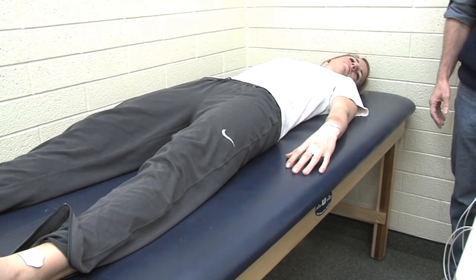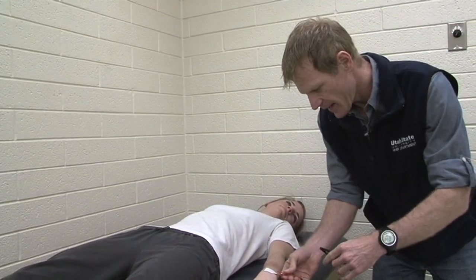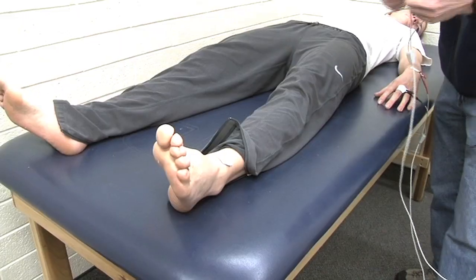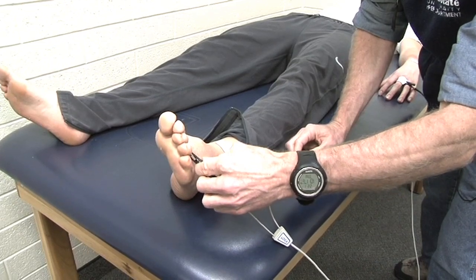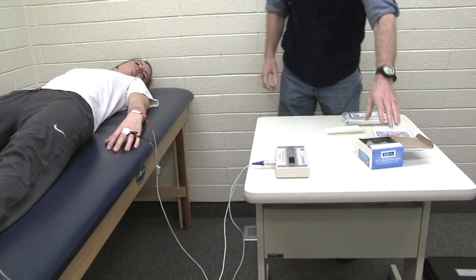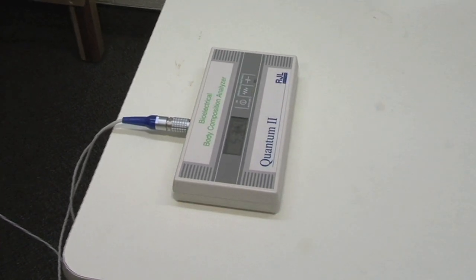Our setup is all ready, so we're just going to hook up the electrodes here. We have red and black leads — just like hooking up a battery on a car, basically. The red lead is proximal and the black lead is distal. I just turn on the device and it's going to give me a resistance reading. This is measuring the resistance to the electrical current going through her body, and this number is in ohms. Right now she has 534 ohms.